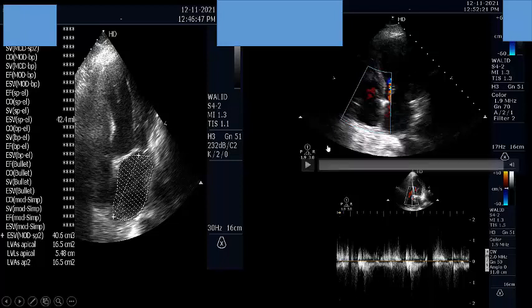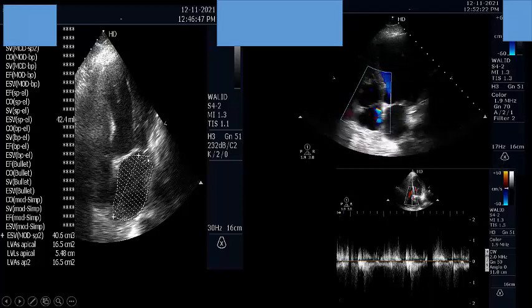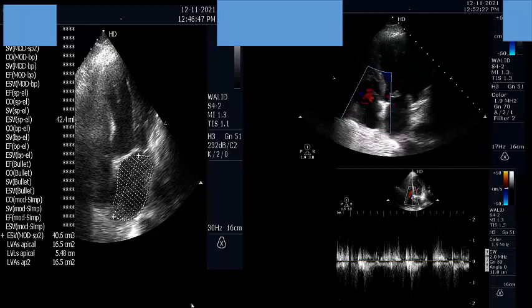Let us go to the second point. The second point is the tricuspid valve regurgitation velocity. If more than 2.8 meters per second, that means another positive point, but here it is less than 2, so a negative point. And the third point is the left atrial volume index. If more than 34 mL per square meter, it will be another positive point, but here it is 42 total. The patient's body surface area is 2, that means it's 21 mL per square meter left atrial volume index, so it's another negative point. So our patient, according to the American Society of Echocardiography, has grade 1 diastolic dysfunction with normal left atrial pressure.